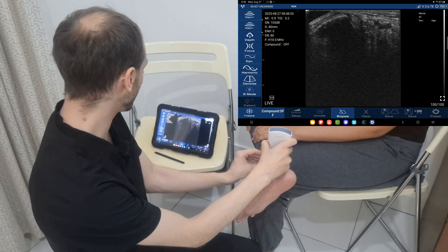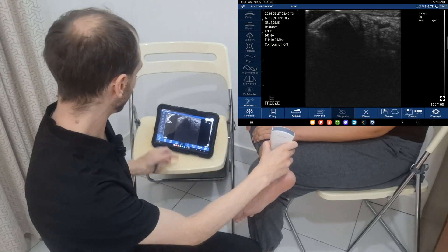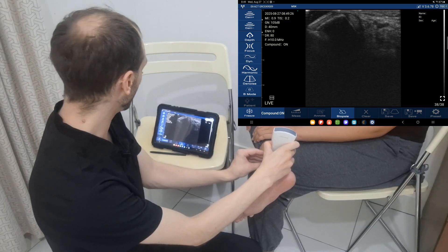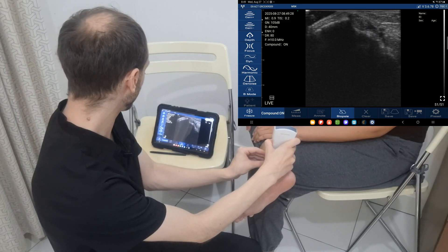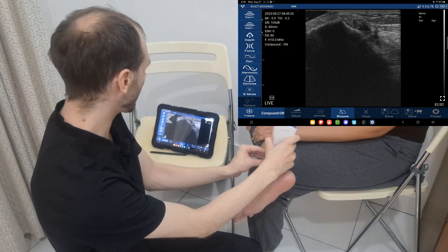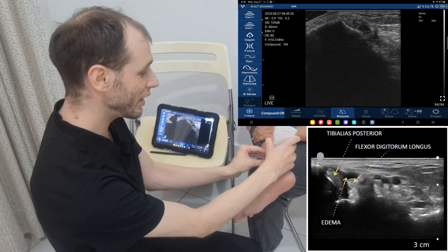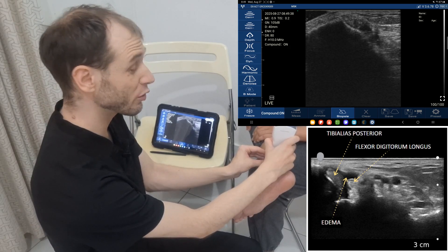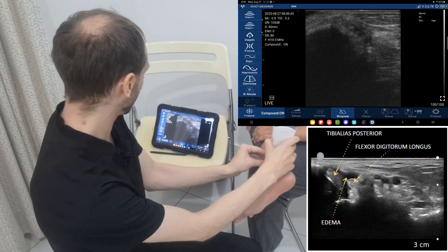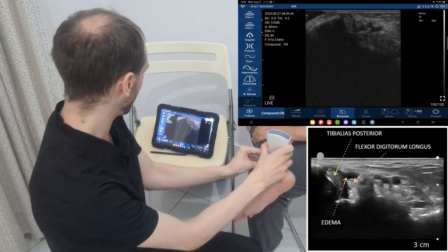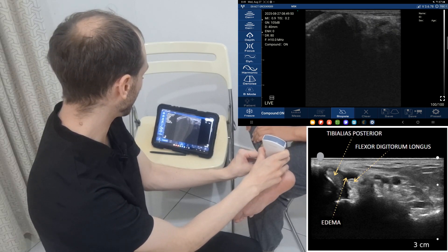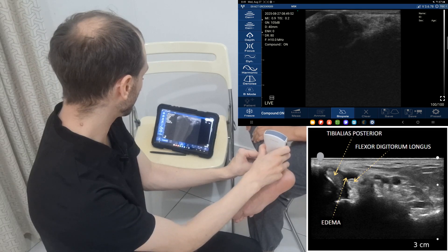There's the tendon — it's right up against the bone. We can try to follow it a little bit as it goes behind. Sometimes you'll see fluid around the tendon, which could be a tenosynovitis but can also be fluid from a tear. You can just follow it up. See how dark it gets from anisotropy, so I really have to tilt the transducer back and forth to make sure it's still there.